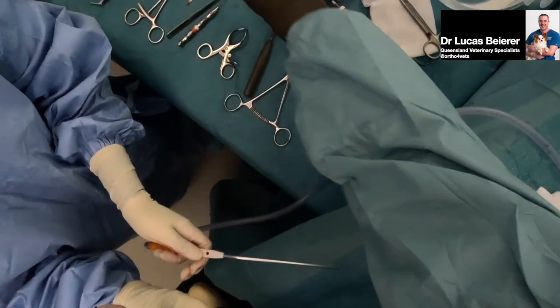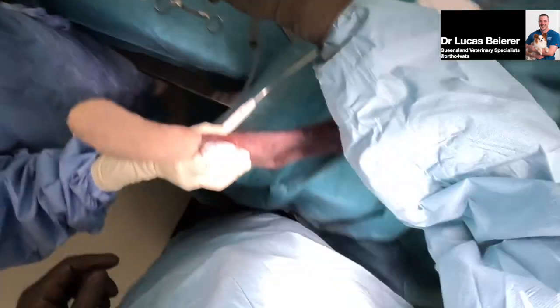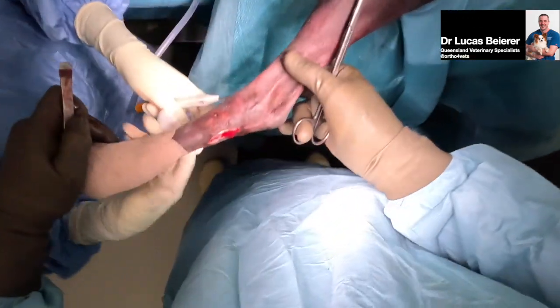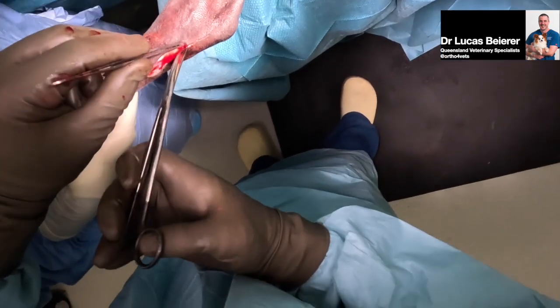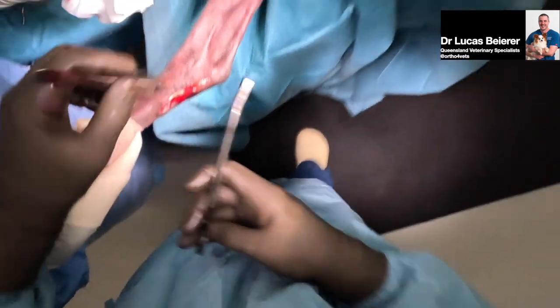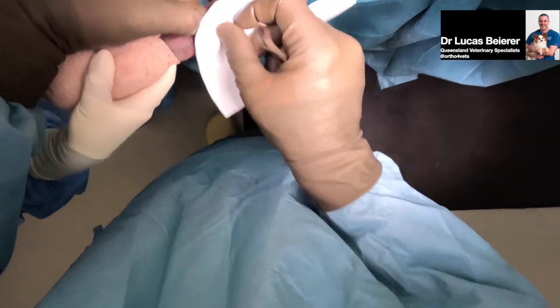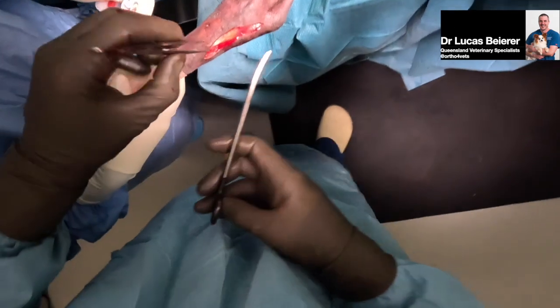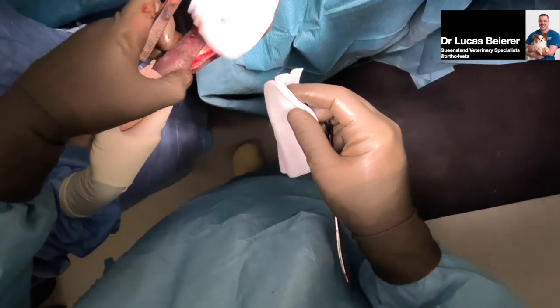All right, those forceps. A bit awkward, isn't it? Really, the smaller incision we can make, the better. Can we get an oscillating saw, please? Get that 15 blade.